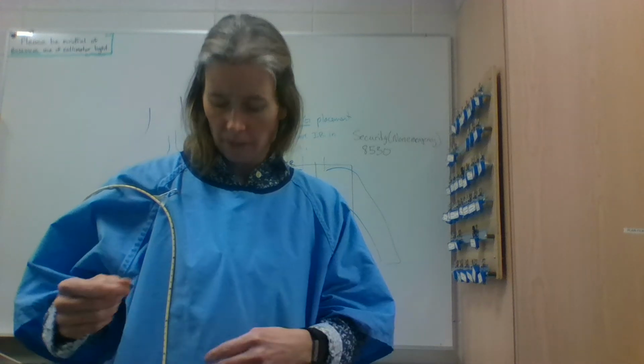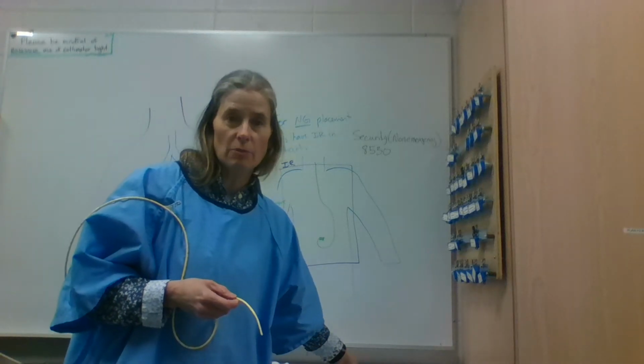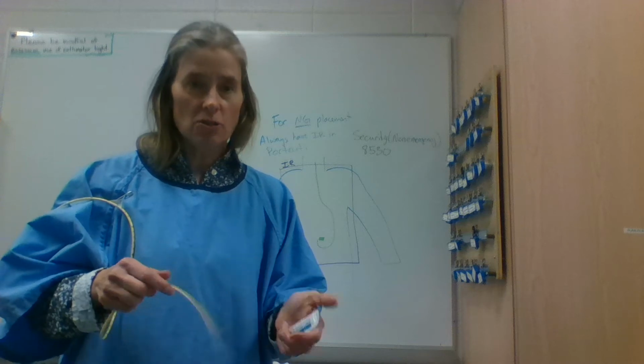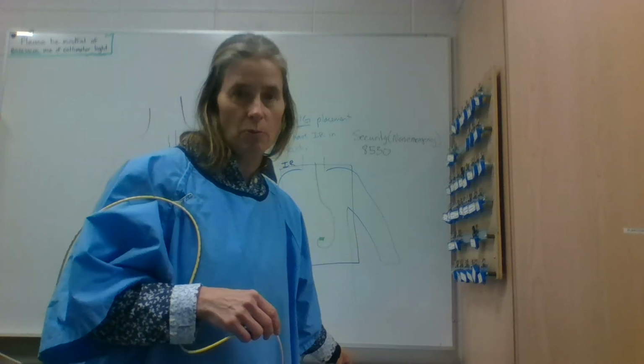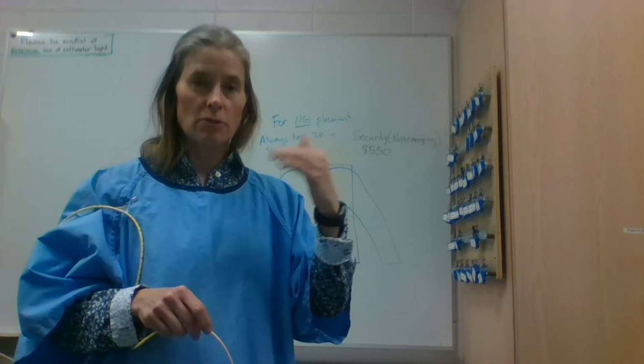Okay, all right. As far as the NG tube itself, we don't actually perform insertions of NG tubes, but it is done with lubrication and what have you, and the patient's encouraged to swallow, and that helps with the drinking mechanism.